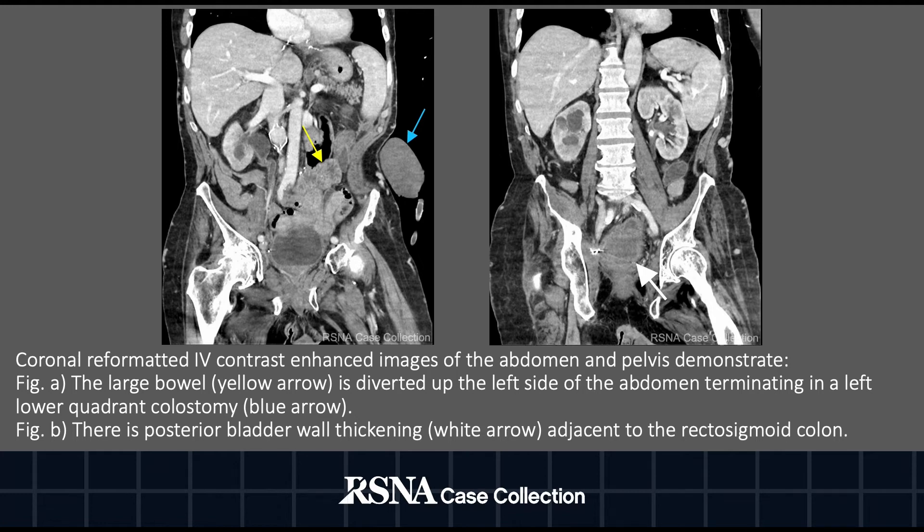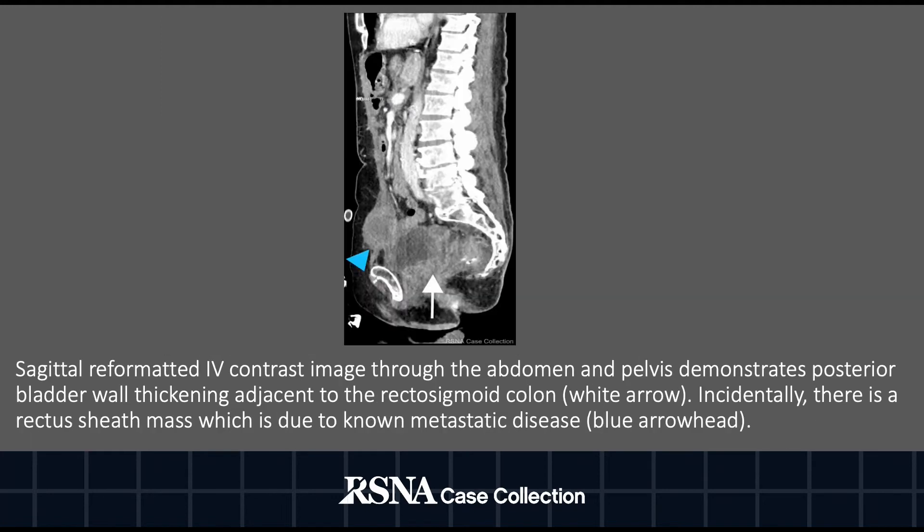On figure B, we can see that there's posterior bladder wall thickening demonstrated by the white arrow adjacent to the rectosigmoid colon. Sagittal reformatted images re-demonstrate posterior bladder wall thickening adjacent to the rectosigmoid colon.